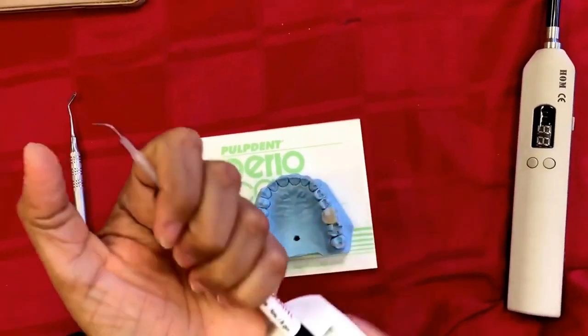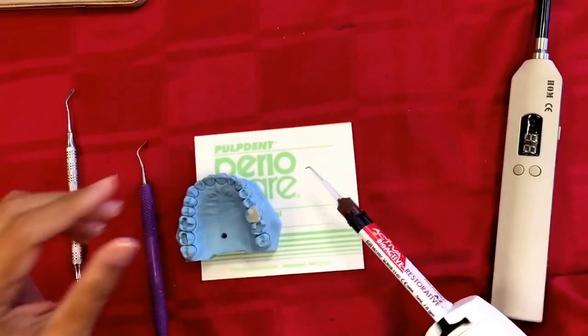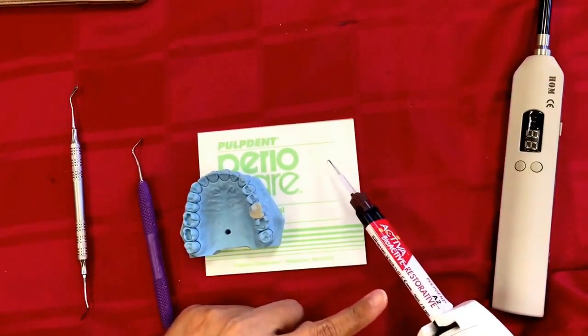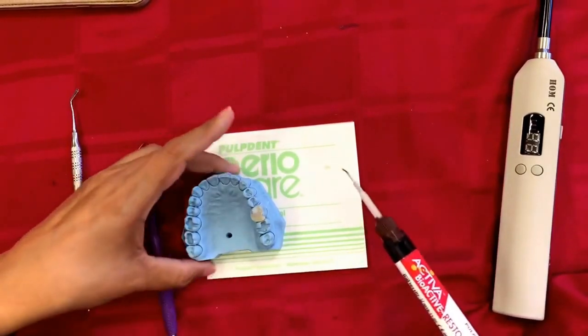You can do it at 45 degrees, you can do it at 90 degrees, and the steps become so simple. Before you start putting it onto the tooth directly, squeeze out a little on your dispensing pad first — and now we are ready.